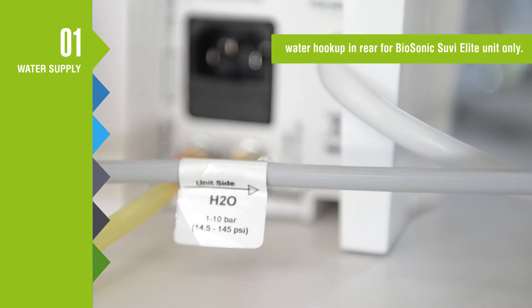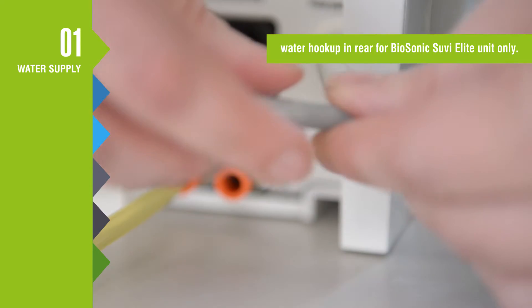If you have a Biosonic Sous Vide Elite unit, your water supply will hook up in the back of the unit.